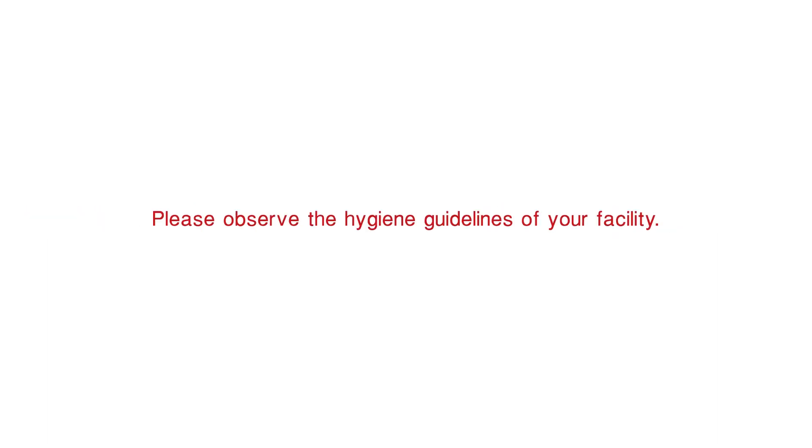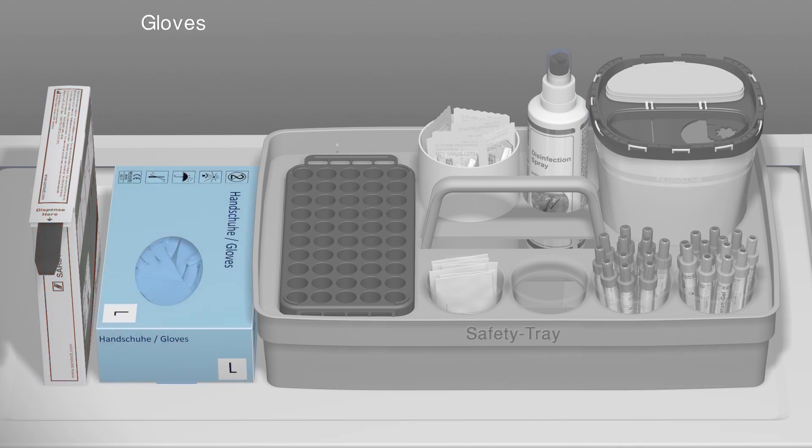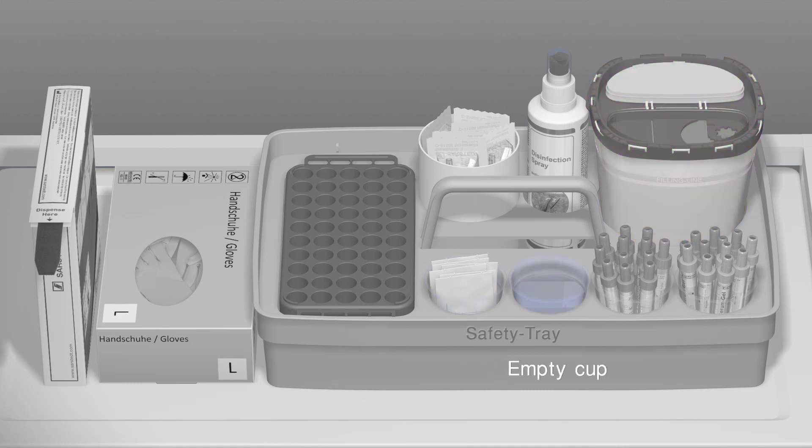Please observe the hygiene regulations of your facility. You will need the following items: a tourniquet, single-use gloves, block rack, a safety needle, disinfectant, a multi-safe disposal box, antiseptic swabs, an empty cup, and the S-Monovettes.